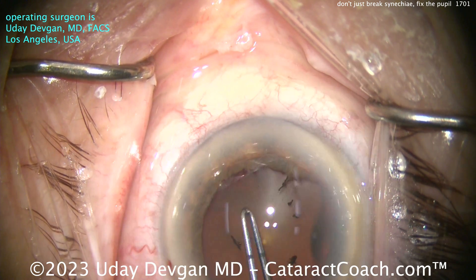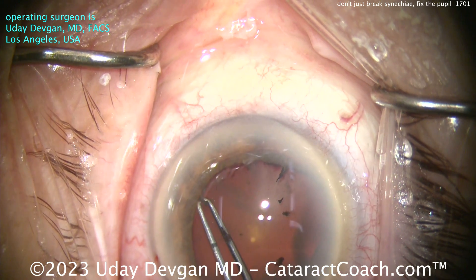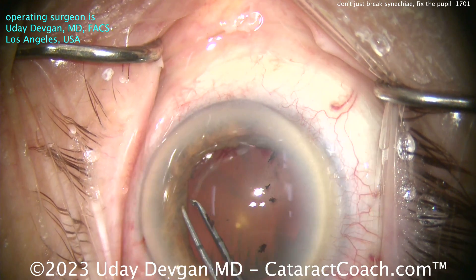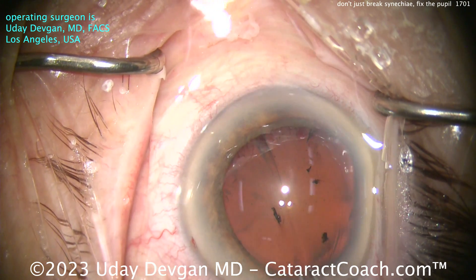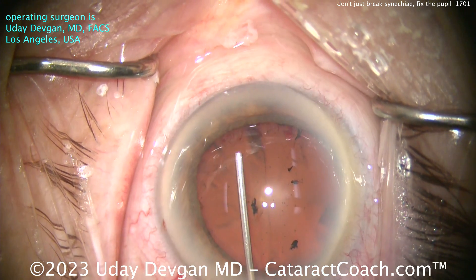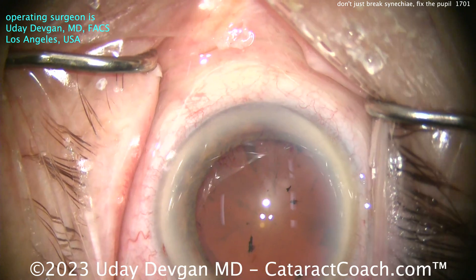Remember the iris is a pretty vascular tissue. So we'll peel off as much as we can. If you can't get all of it off, it's okay — just breaking a little bit of that membrane will be enough to help restore normal pupil anatomy. The balance here is to do no harm. So I'm just pushing the iris out, and I think I'm pretty happy with that. We've removed a lot of the membrane, not necessarily all of it, but we've broken the attachments there.